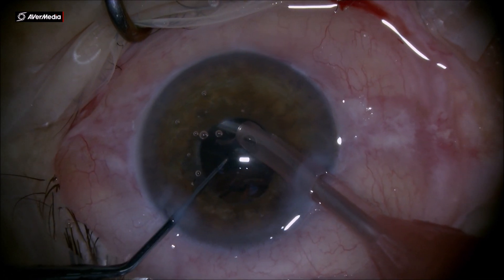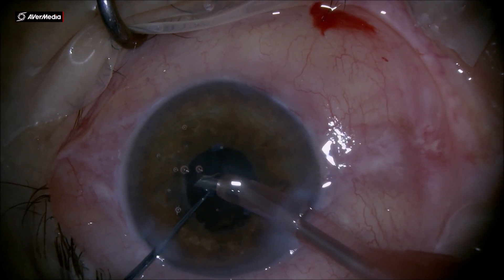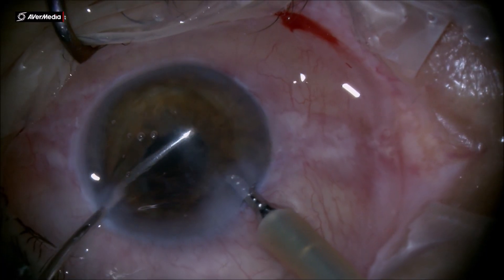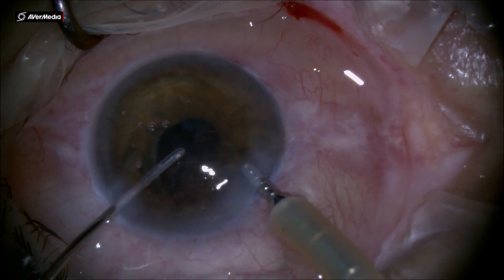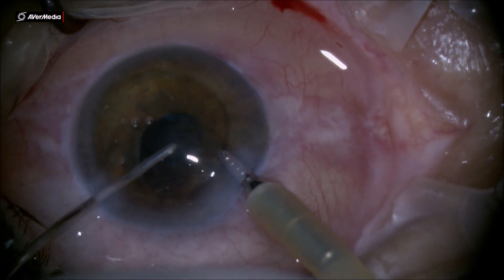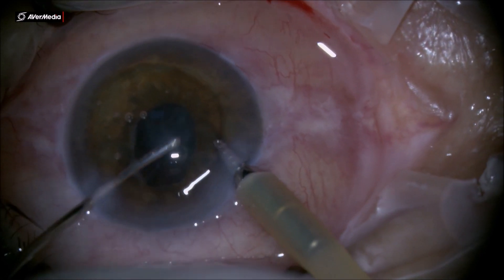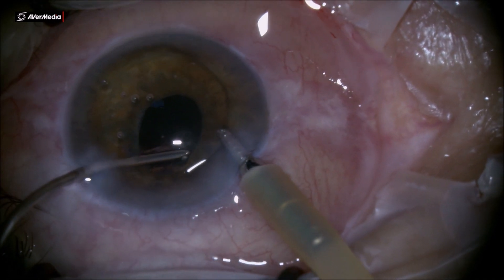I'm using the chopper here to protect the posterior capsule while doing cortical aspiration. Then using the maintainer in the main incision and the aspiration needle, I'm making sure the bag is free of any cortical remnants. At the end of the cortical aspiration, I place some viscoelastic inside the anterior chamber.